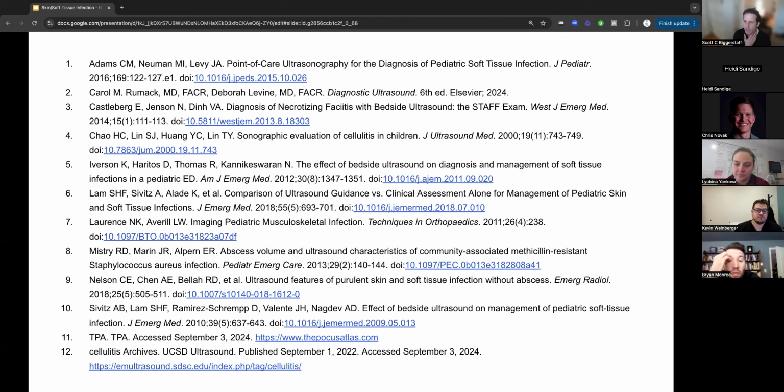So one other thing that I didn't really go through is sometimes you'll see lymph nodes that look like abscesses, and it's just a little bit more nuanced, and you need a little bit more experience, I think, to recognize those. But that is a pretty common concern. Obviously, in kids, you end up with a lot of neck swelling that's unilateral, and then you end up hemming and hawing about whether it's a necrotic lymph node or an abscess, and then somebody has to go in and drain it or remove it, or you're going to treat them with antibiotics for an eternity.